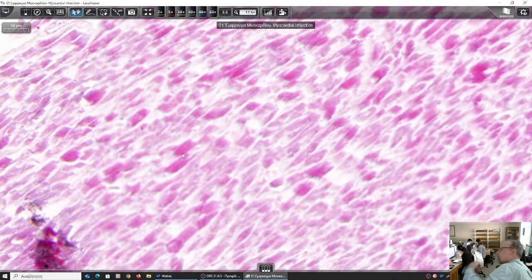the pre-existing viable cells. And what are the signs of necrosis? All striation that muscles have is no longer present. And most importantly, what do these cells lack? They have no nuclei, so they are non-viable cells. So this is an area of acute, hyperacute myocardial infarction, where we see fragmented myocardial fibers without any striation and without any nuclei, which is compatible with necrosis.